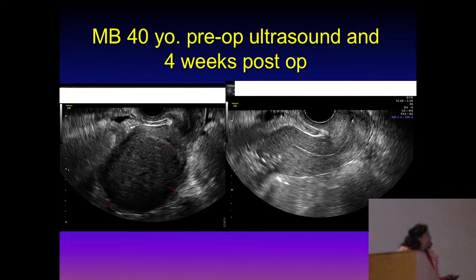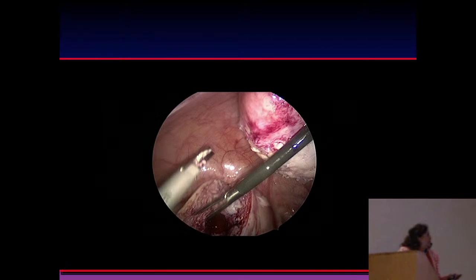And then this is the uterine cavity clearly seen. So laparoscopically, you want to close the cavity in layers. And these barbed sutures have really made life much easier for us laparoscopic surgeons to do myomectomies. Very rarely do we open a patient unless they have like a 36-week size fibroid uterus.